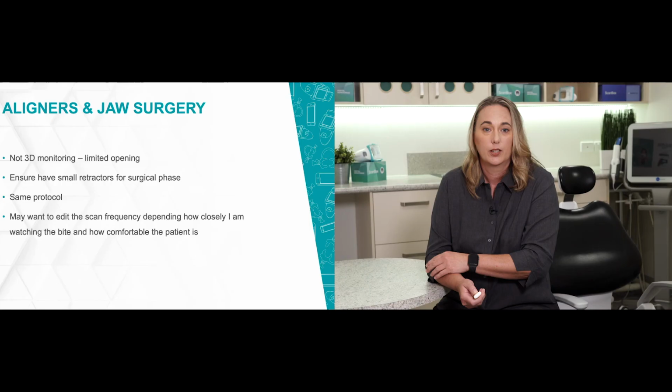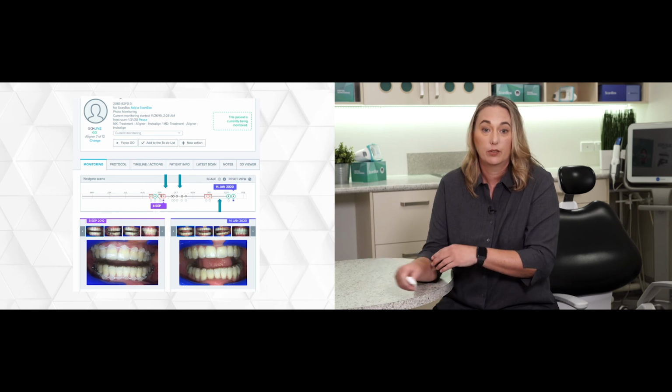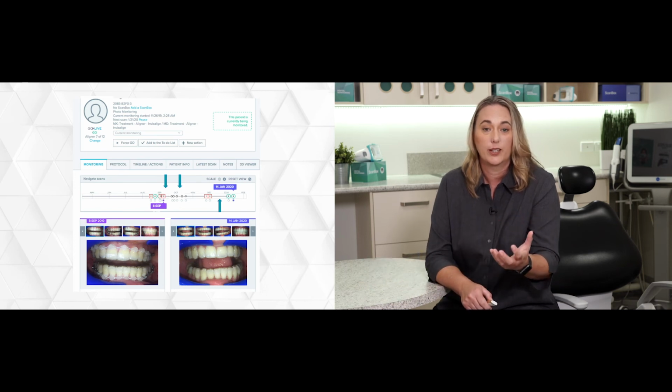The protocol will often be the same because they're not settling, but I need to be checking what we need to check. And sometimes I will edit the scan frequency depending on how closely I'm watching the bite and how comfortable the patient is. So often I'll reset the next scan interval when I check them as they're going through this immediate post-operative phase. So an interesting example of this is this particular patient here.